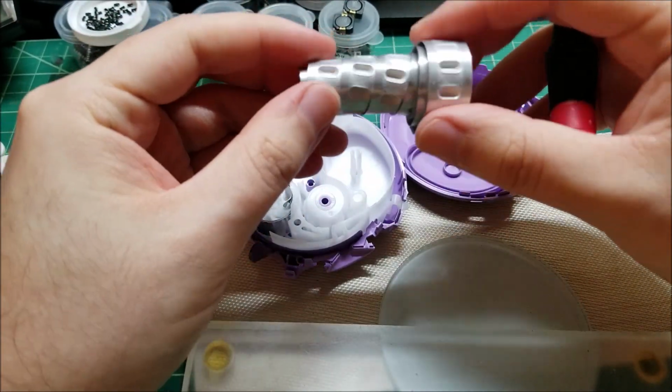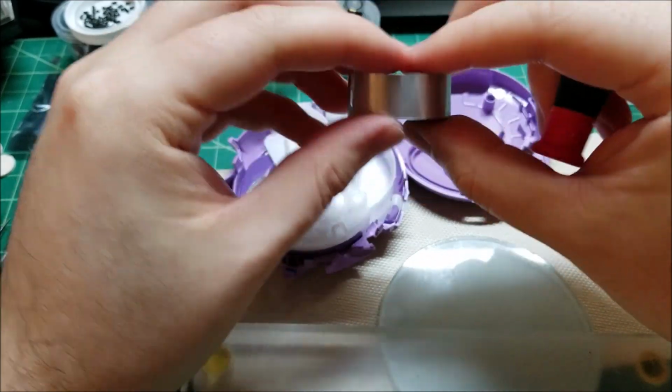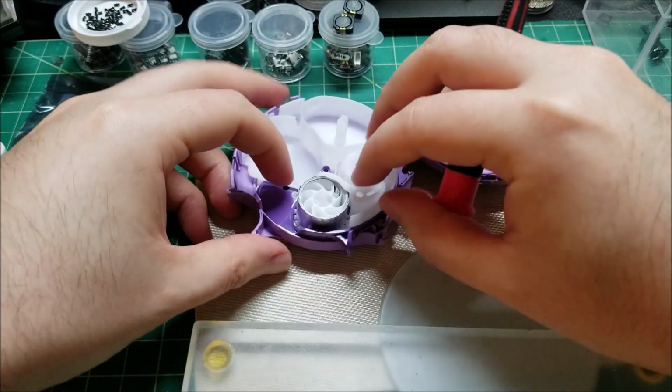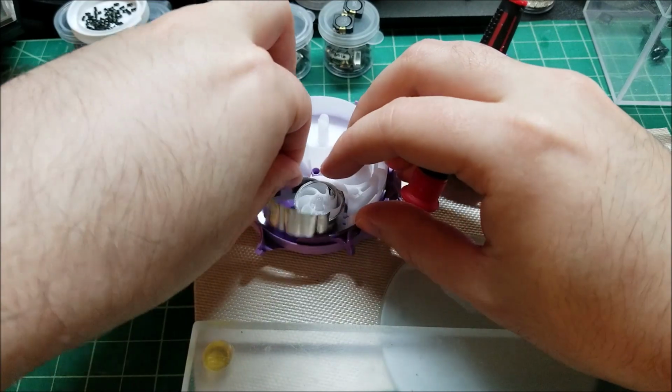And yeah, you could see here, they're like little capsules. That's one side of the medicine transport, I guess you could say. The other side is a foil that just goes on top of that. And let's see if I can pull this one out.